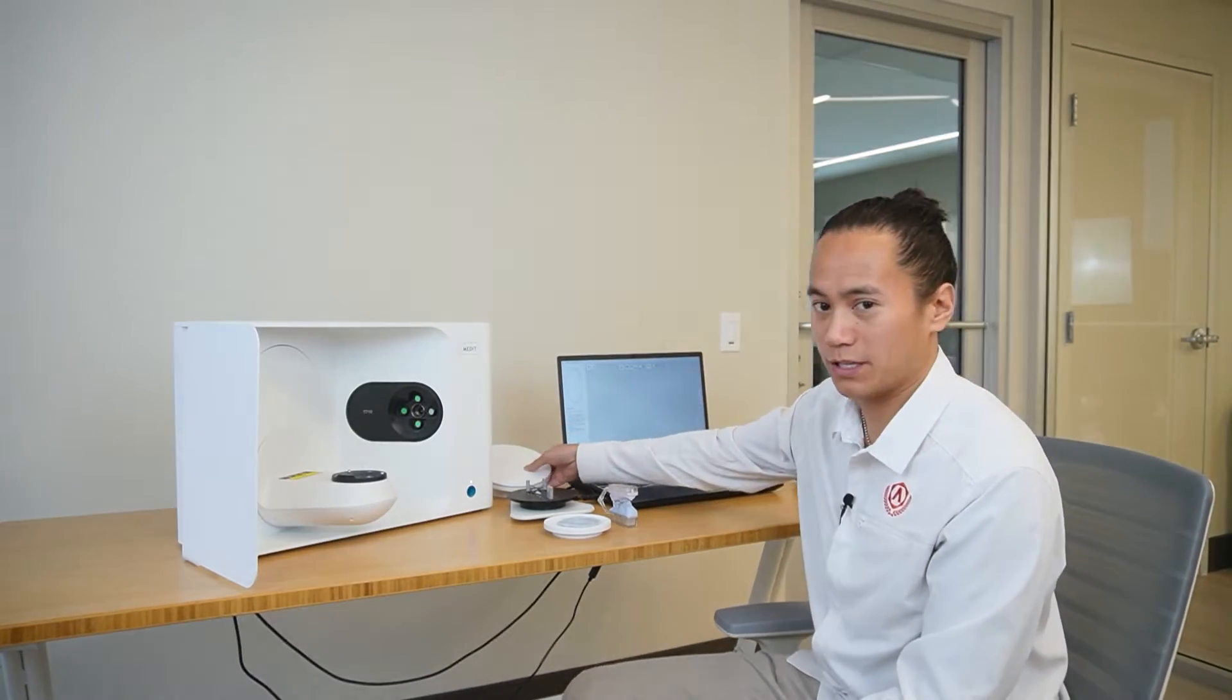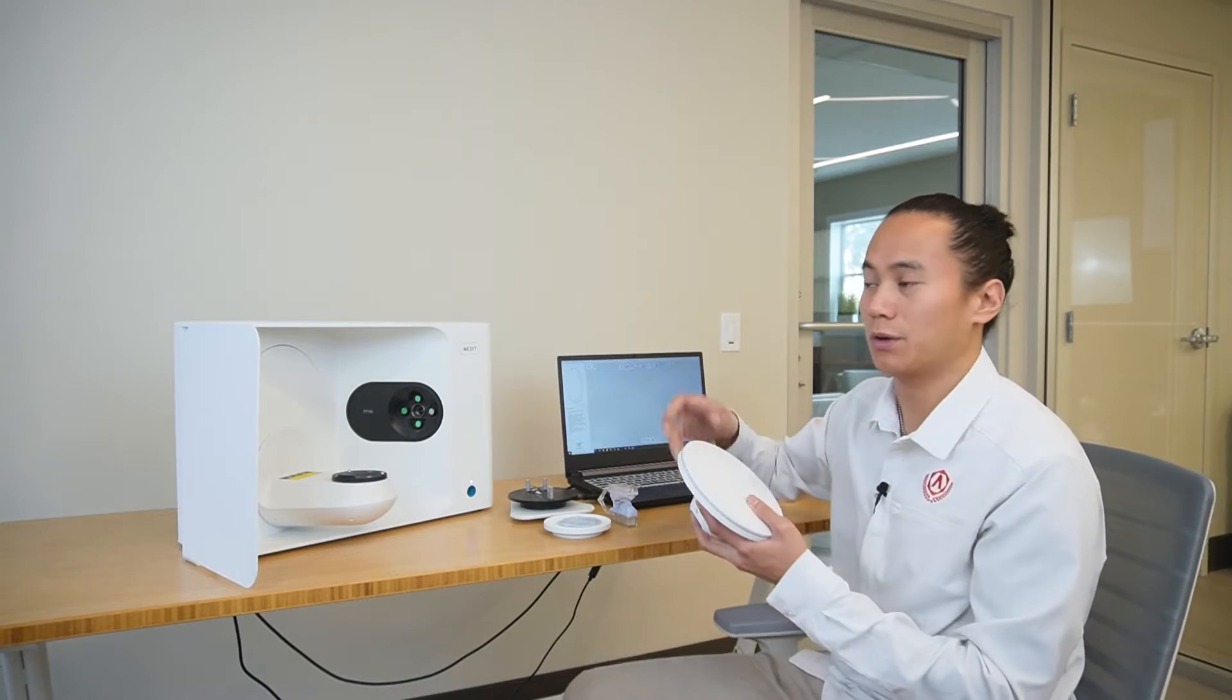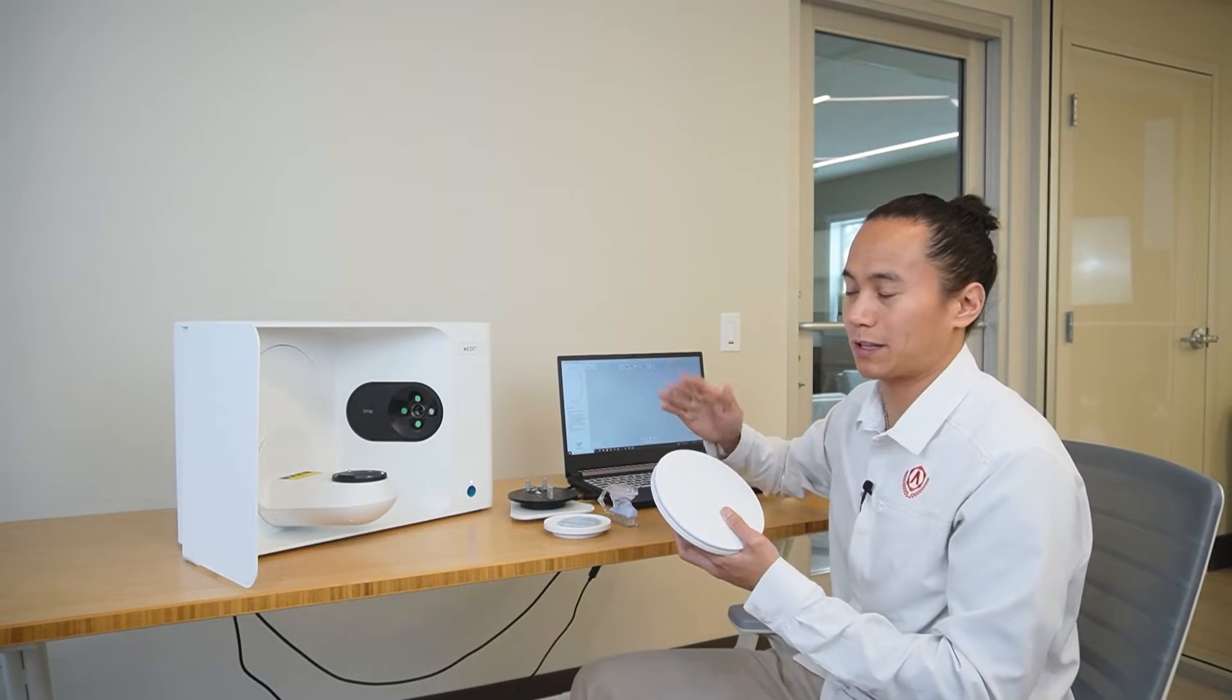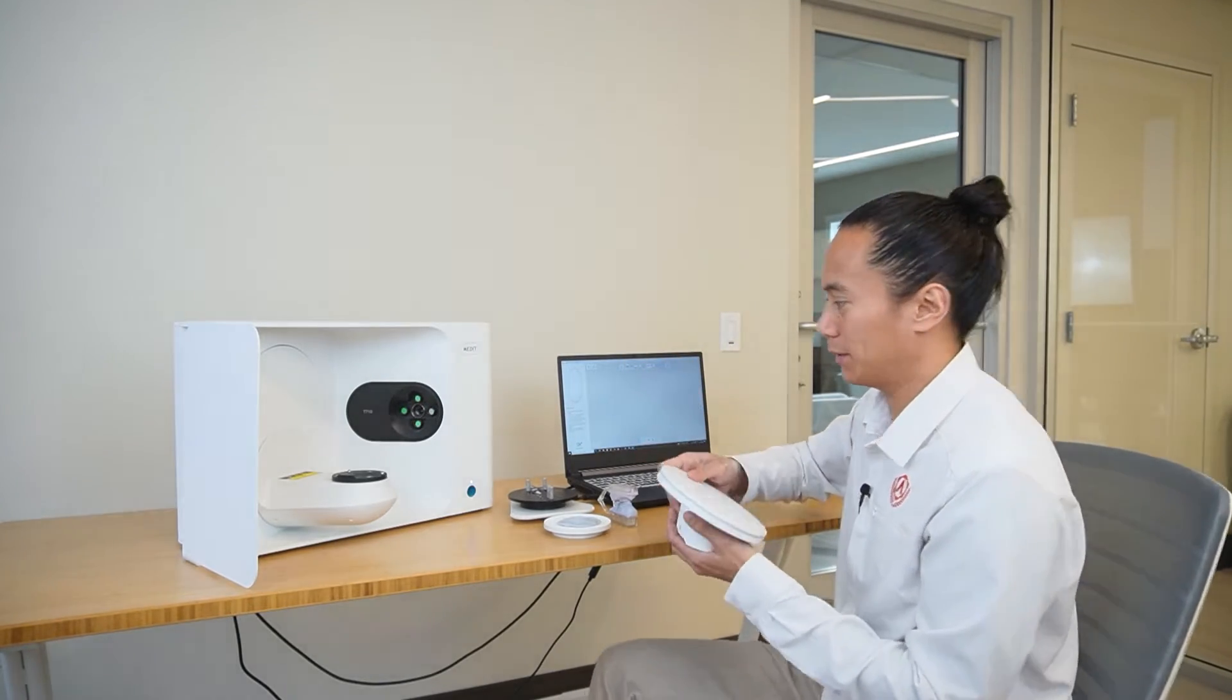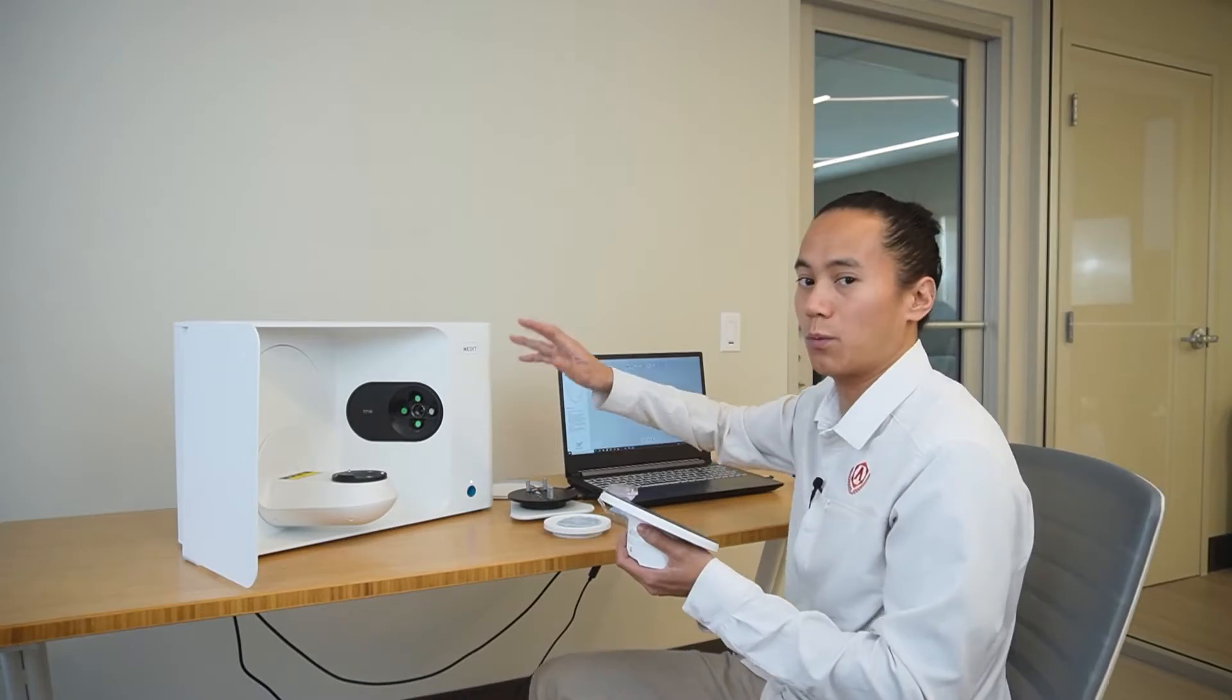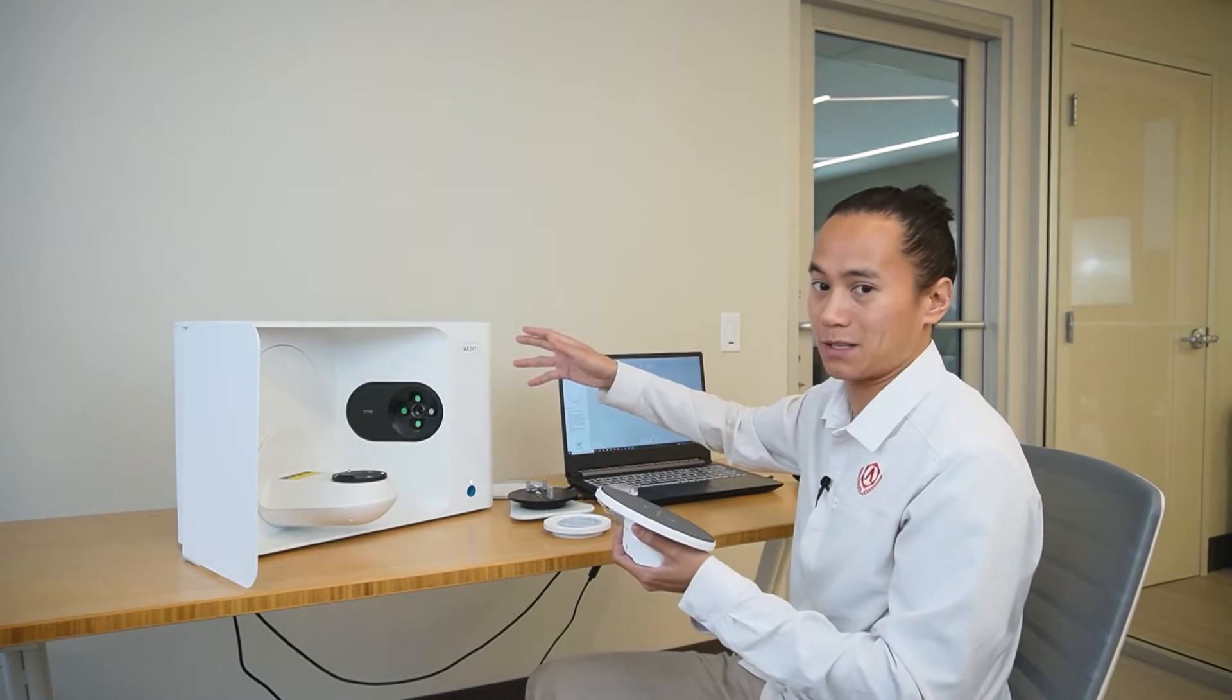Now that the scanner's been installed, the first thing that we're going to do before we start any scanning is calibrate. You should calibrate your scanner every 30 days. The MediLink application will give you a timer for the last time your scanner's been calibrated. In between the 30 days, you will want to calibrate any time that the scanner's been moved.